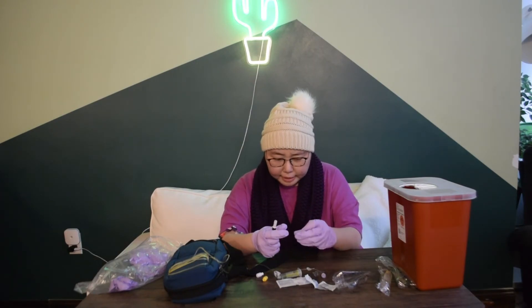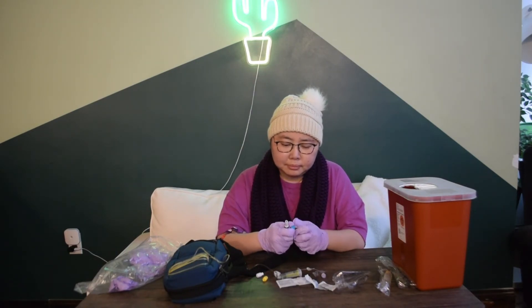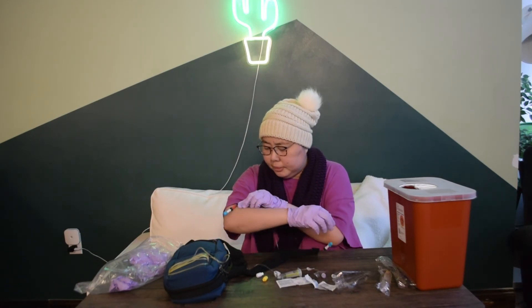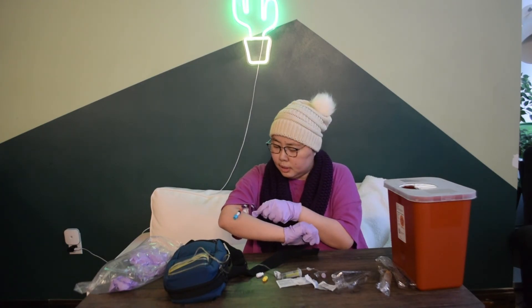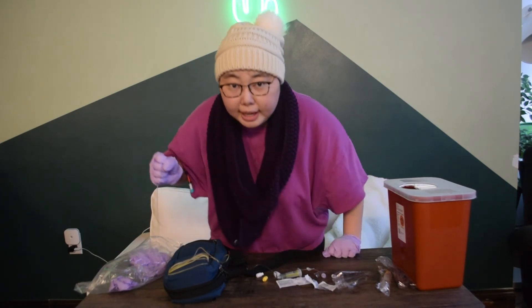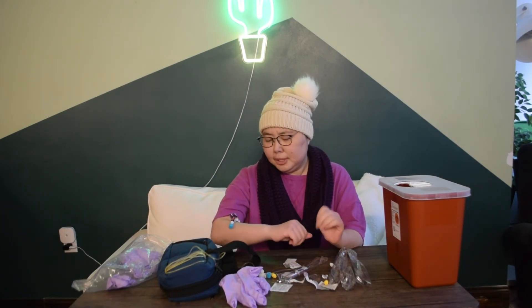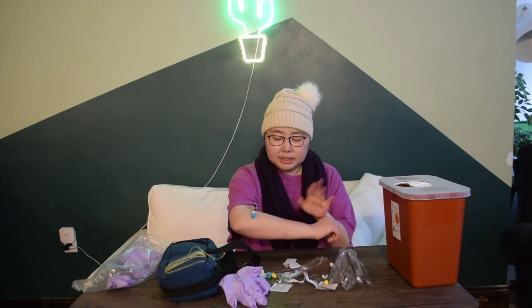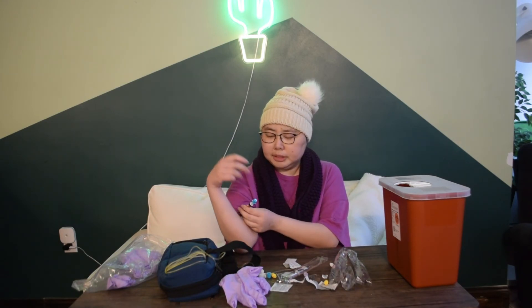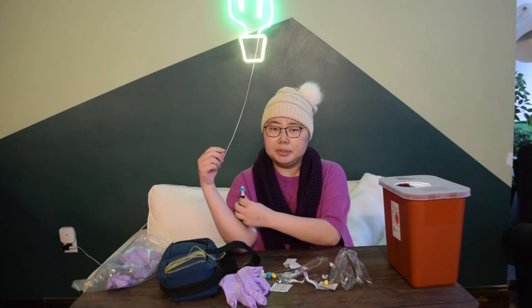They have these nice little caps which have alcohol in them. My camera ran out of space so you missed the whole second one. But for a PICC line, you have two lines so you can run two infusions at once. Even though I didn't run an infusion on that line, I flushed it and used the heparin for the second line, which is shorter because I didn't have another extension — but I can still reach pretty fine.